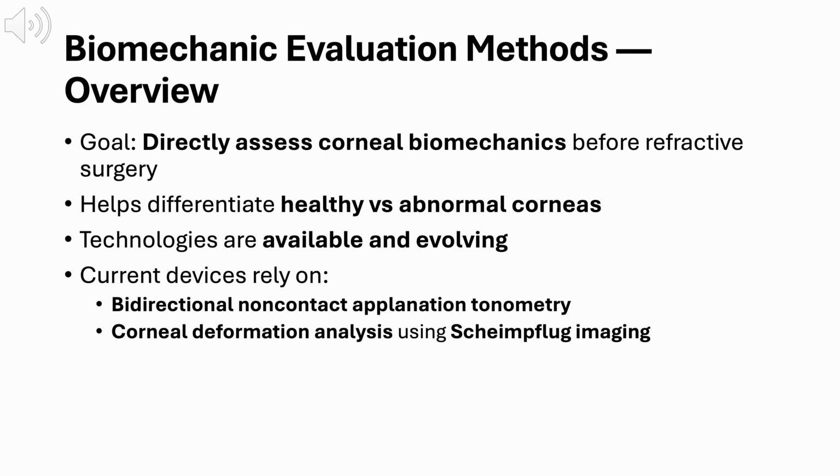Up to this point, we focused on why the cornea behaves the way it does. Now the question becomes how we actually measure that behavior in a clinical setting. The goal of biomechanical evaluation methods is to directly assess corneal biomechanics, particularly before refractive surgery. Rather than inferring risk from shape alone, these tools aim to characterize how the cornea responds to applied force. This approach helps differentiate healthy corneas from abnormal ones, including eyes that may appear topographically normal but are biomechanically vulnerable. As a result, these technologies add another layer of safety to preoperative screening.